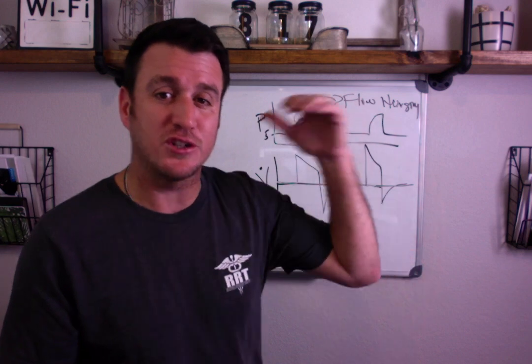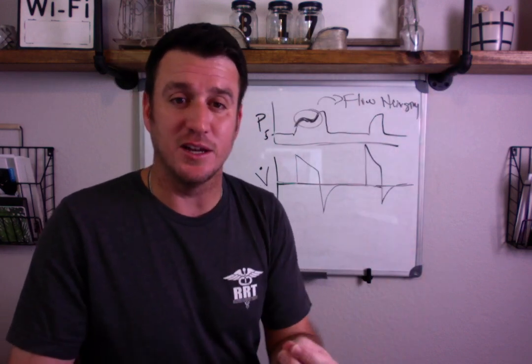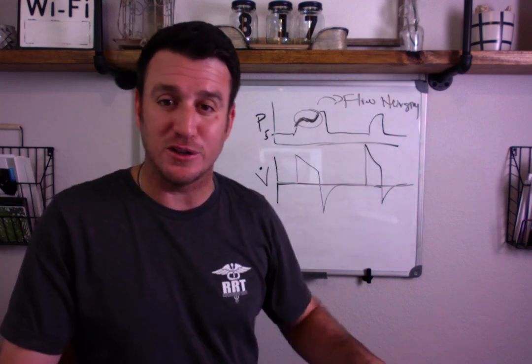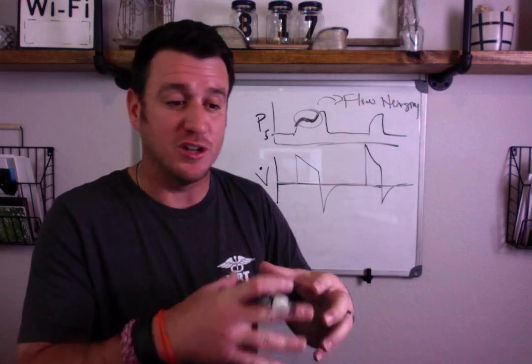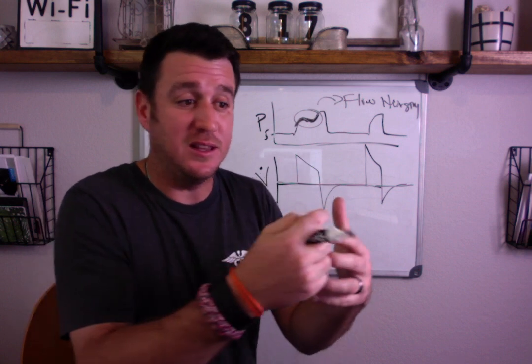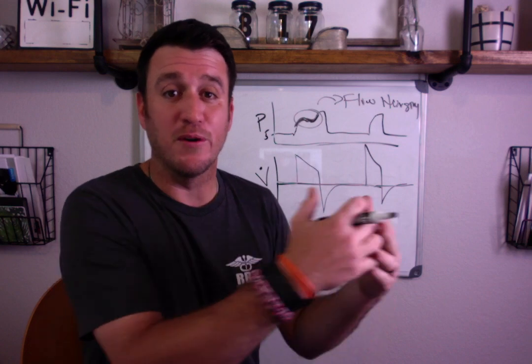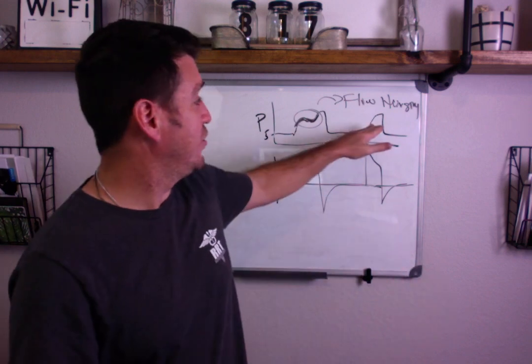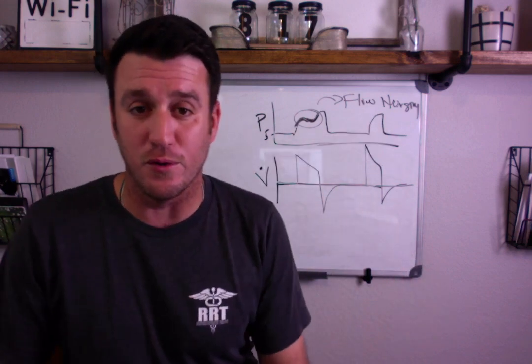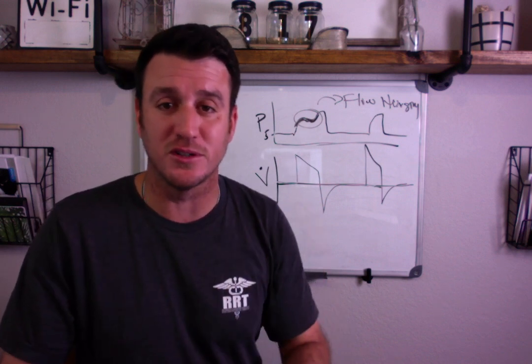Didn't your peak pressures go through the roof? And the answer is no. And the reason it's no is because your diaphragm is dropping so fast, and that's part of the pressure equation, the intrathoracic pressure. And so we were finally meeting that to get a normal pressure waveform. And our pressures went up literally by like 3 to 4 centimeters of water pressure.